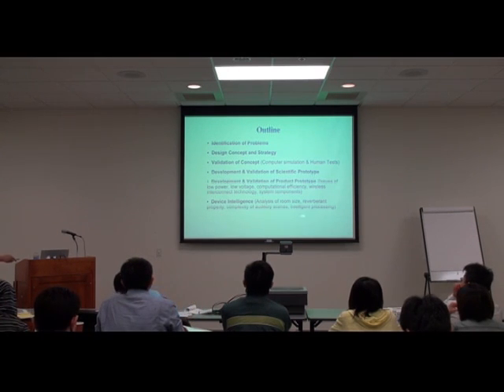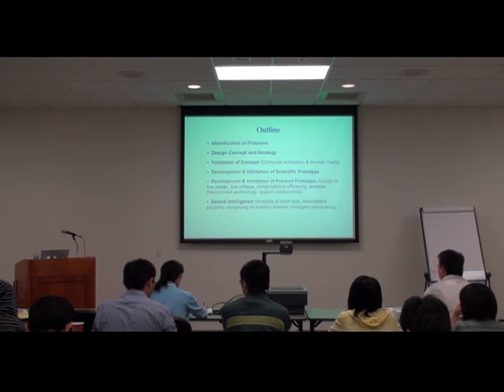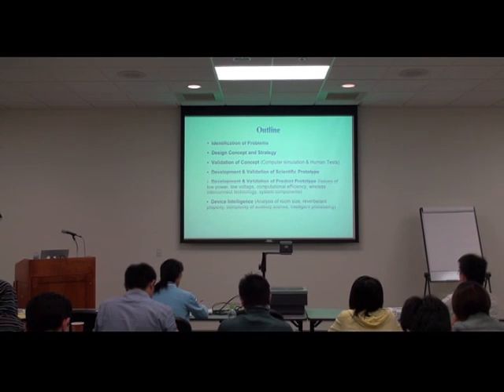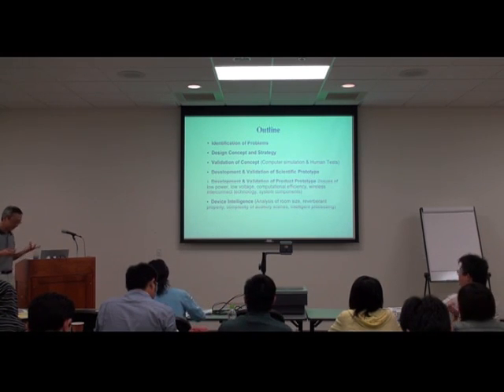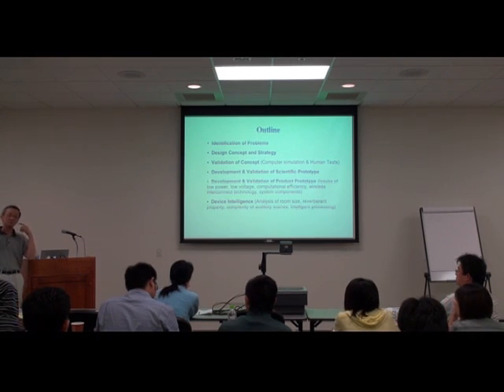But nonetheless, we also have to consider, for the overall product, the designing of the intelligence in the device, because a hearing aid is not just a simple device of amplification of the sound that we don't hear, but rather it needs to mimic what our ears tend to do in our everyday living condition.